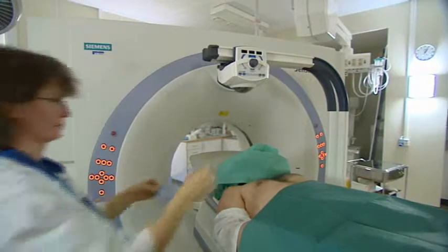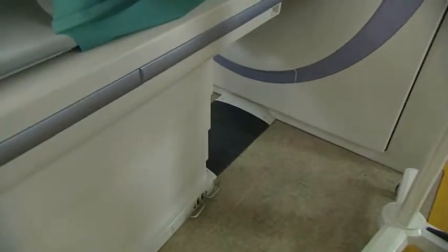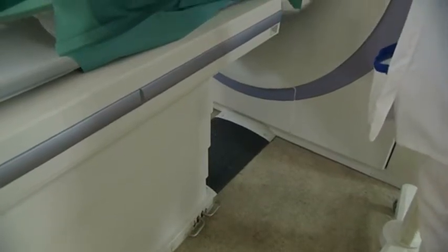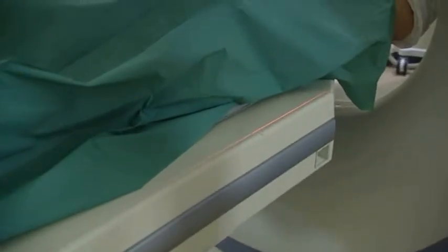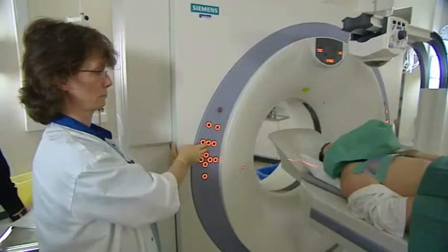The SimpliCT's position on the floor is dependent on the puncture angle. The flatter the angle, the further from the floor the unit should be. Be sure to communicate with the radiologist during the calculation to avoid having to reposition the SimpliCT. If the unit is placed away from the table, the line laser can be angled by turning the angle input wheel to raise the line so it illuminates the edge of the CT table, making the alignment possible.